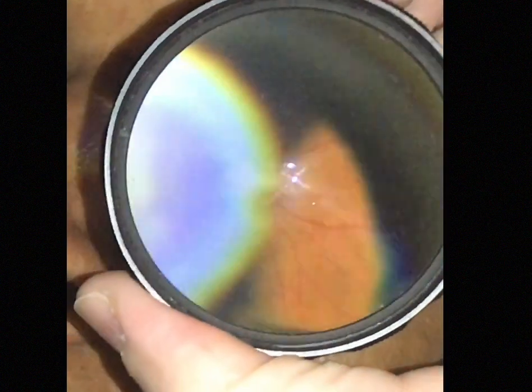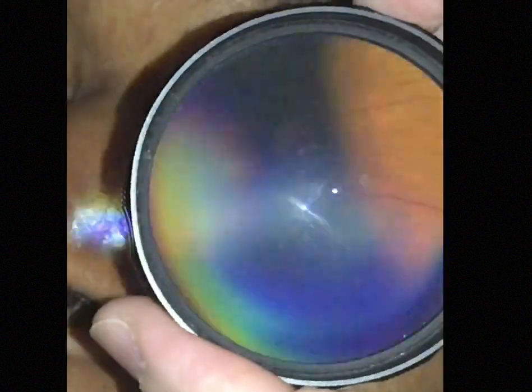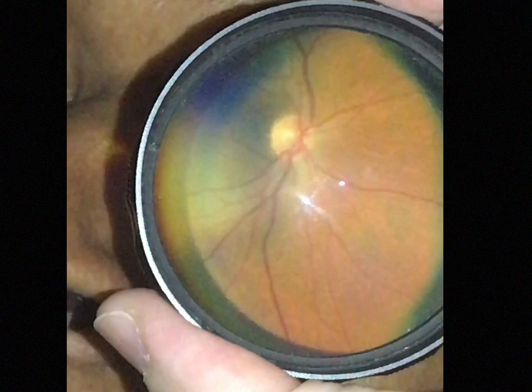It's called the Allman Indirect. You can do autofocus — just by clicking on the autofocus button you don't have to use your fingers and you can hold your lens more steadily. But you can also adjust it manually if you feel like there's a lesion in the vitreous or there's a lesion deeper in the retina where you need to adjust your focus.